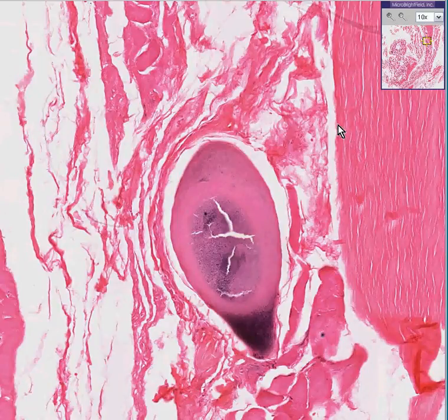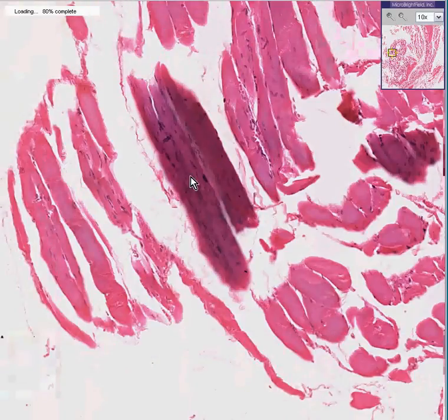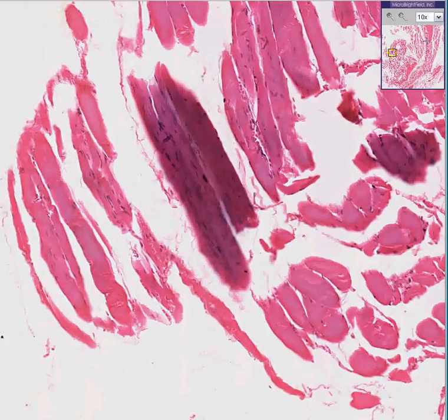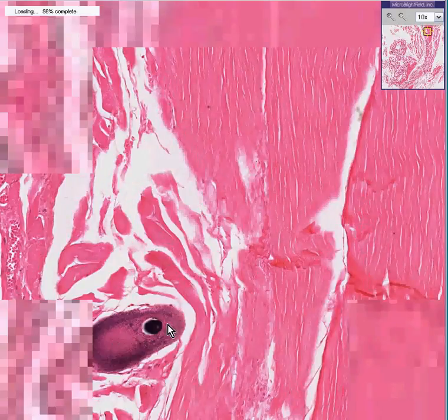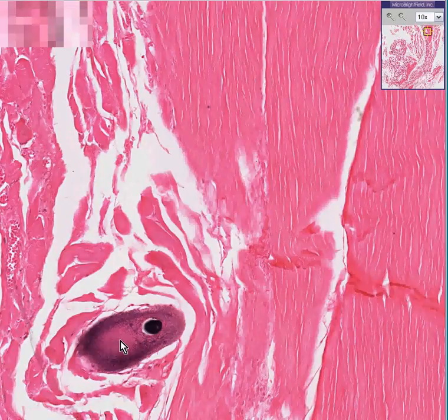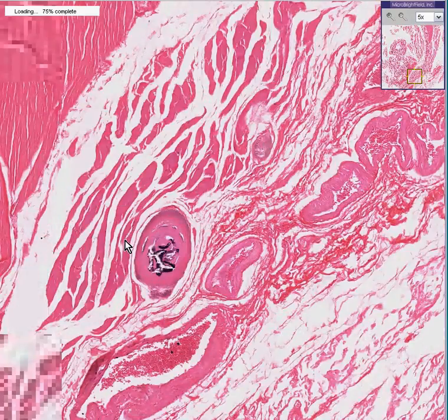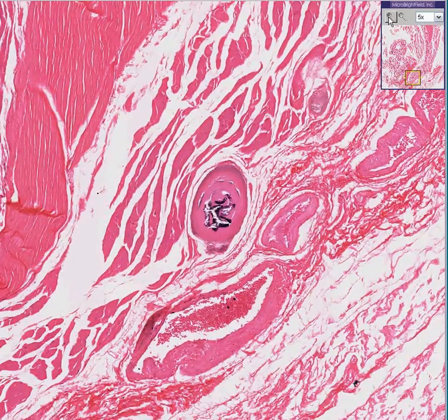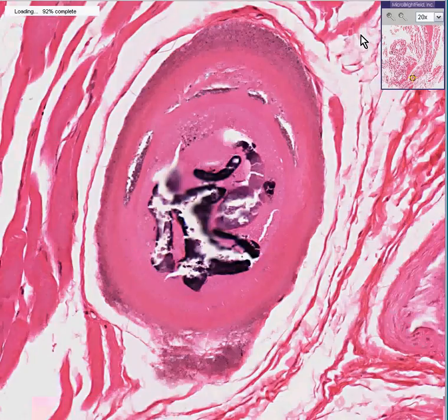Let's look at a couple more just to show you their variation. That's not one at all — that just happens to be a skeletal muscle fiber that, for some reason, is staining darker than everything else. Here's another one looking very calcified and very unhuman, like nothing you would ever see in a human histology lab. Here's another one, and probably another one here. Notice they just look kind of hyalinized — calcified in the center or even towards the periphery sometimes. This is a classical encysted cyst of trichinosis within skeletal muscle.